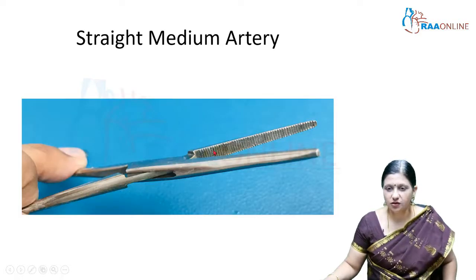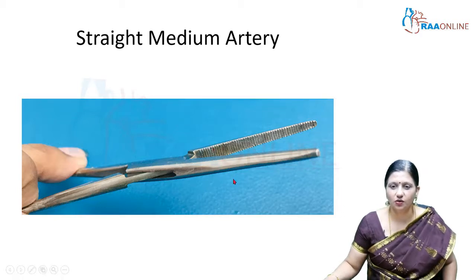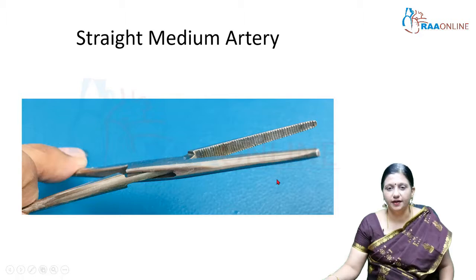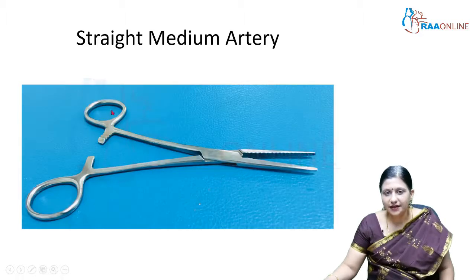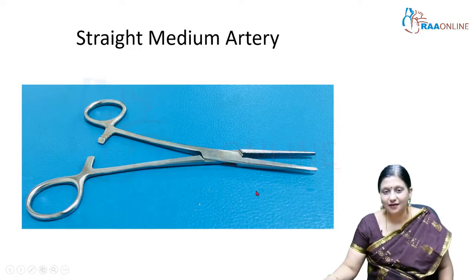This is a straight artery forceps. It also has linear serrations and is medium in size. Other variants include the small artery and the long artery — the small one is also called a mosquito. The straight artery is used for holding the peritoneum while closing the abdomen. It has the same latch, clamp, and crush mechanism.